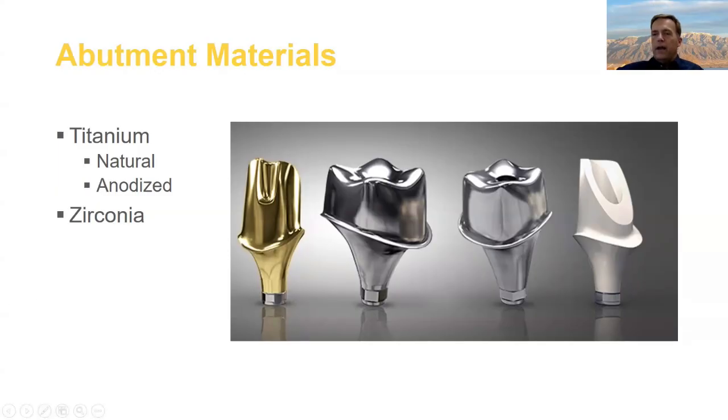Zirconia, on the other hand, as you know, is very, very biologically friendly, perhaps even better than titanium. And it looks pretty with thin tissue, obviously a lighter one like this. These days, you can even get these in 2-shade. So it would really look nice on a thin buccal or maybe in a lateral, something like that, where you need really, really nice aesthetics.